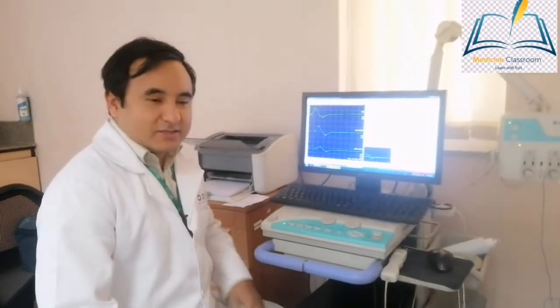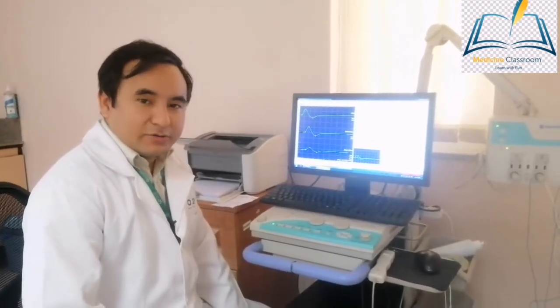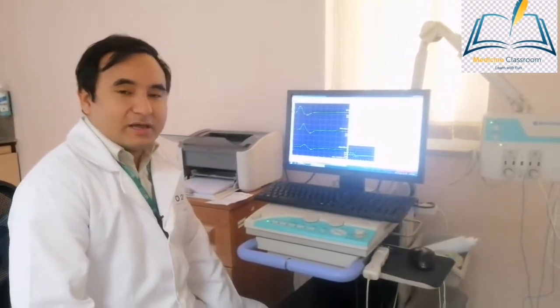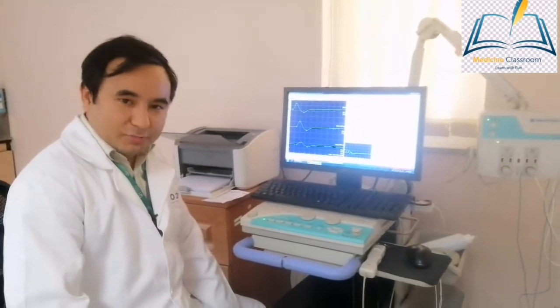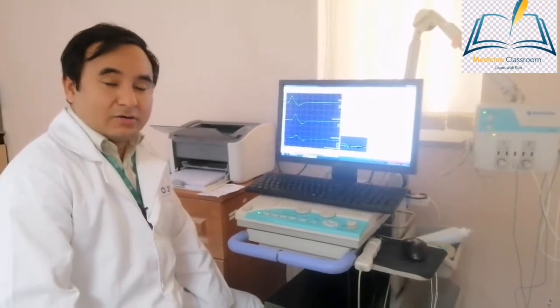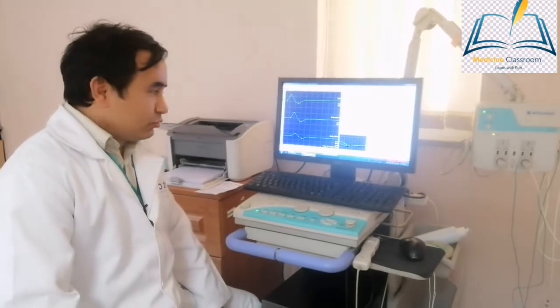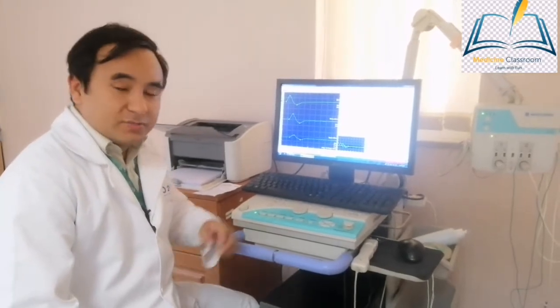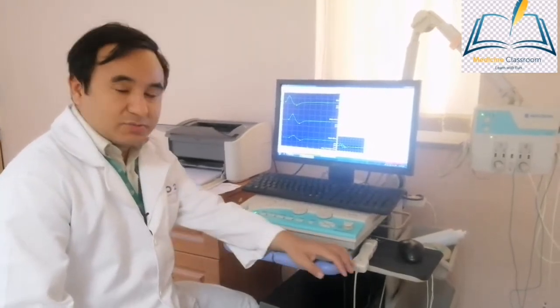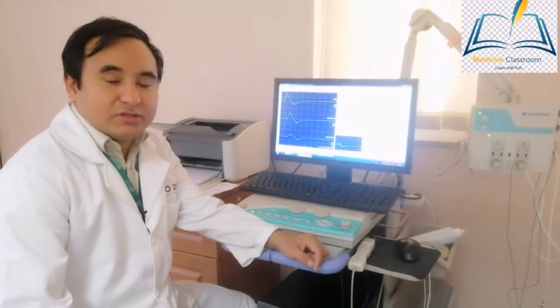Good morning friends. Today we will discuss the nerve conduction study of acute inflammatory demyelinating polyneuropathy, also called Guillain-Barré syndrome. The case history of this patient was that the patient presented to our OPD with a complaint of bilateral upper limb as well as lower limb weakness for four days of duration.